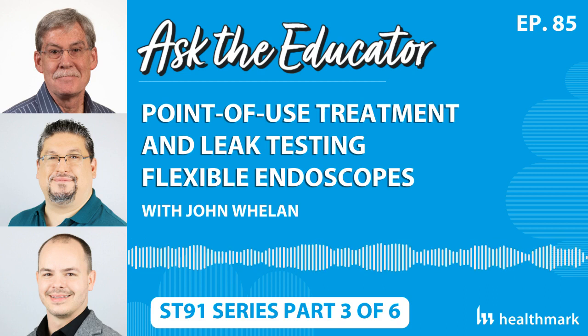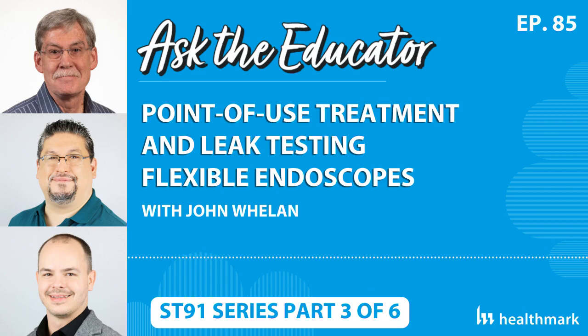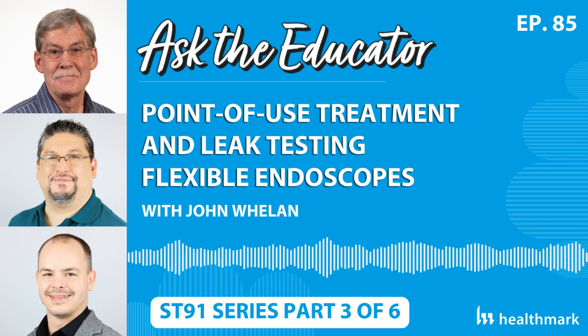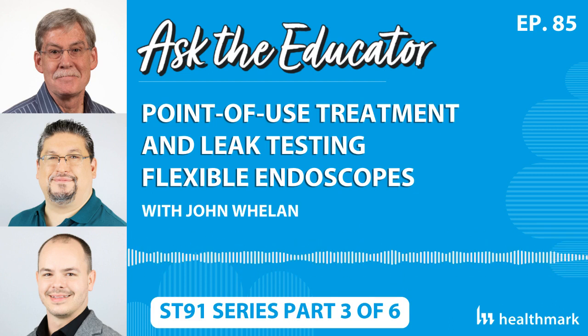There's been various leak testers that people have used over the years. There's manual handheld ones with a bulb, and then there's automated ones, different brands, different models. Similar to monitoring with PMs and the functioning of any equipment, we're asking now in ST91 that leak testers deserve that same level of quality control, so that we need to make sure the PSI is correct, not just that it makes a sound and you can tell that it's on because you hear a motor running or you press a pin and hear a whoosh sound. We need to know that it's delivering the correct PSI.